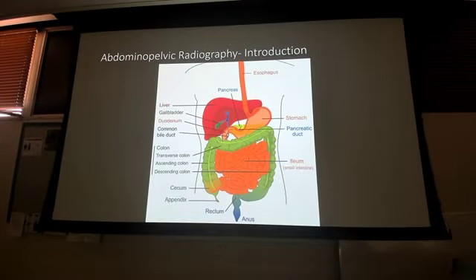There's your anatomy. Shocker. It does not always look pretty like that. You can't just be like, oh, it's over here, so it's the large intestine. You'll have to trace this out, and we'll teach you how to do that, right? Notice how we don't even have a spleen over here. I promise you, spleens are still part of our anatomy. So these are anatomical pictures just to give you an idea, but understand the general areas of where the anatomy is. It will help you when trying to figure out what's going on with each of these images when you look at it.